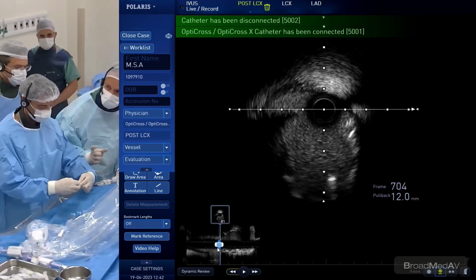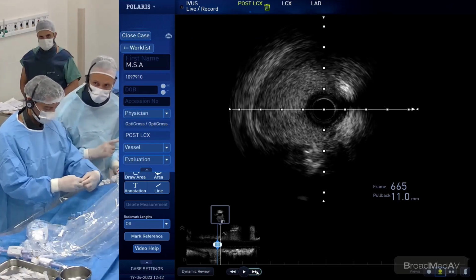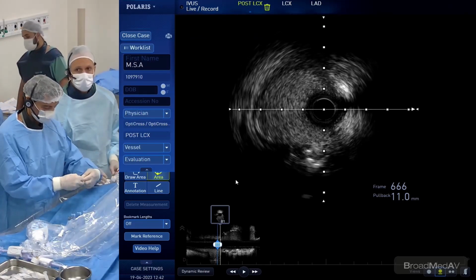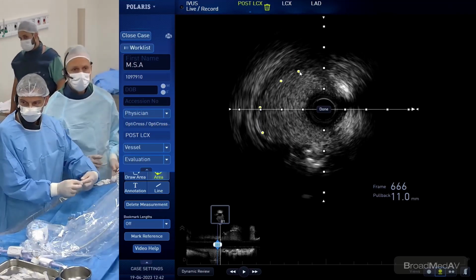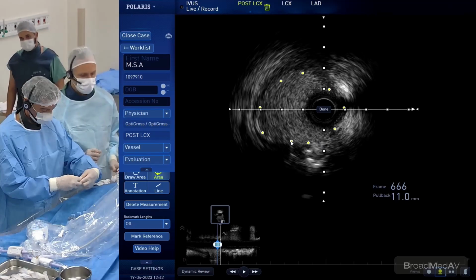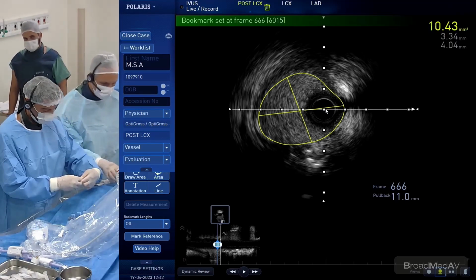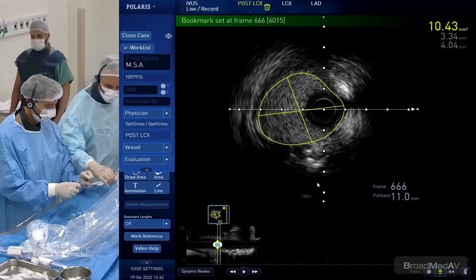Yep. Renata, o heparina, tá? Heparin. Já fez, ok. Que tipo de stent? So, que tipo de stent foi? Okay. So here, não tinha que ter usado os dois. Very close to the ostium, right, Wagner? Queria que usasse um Inspire. Só um pouquinho.